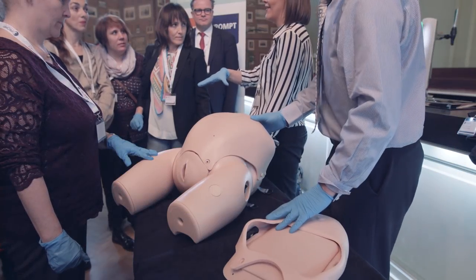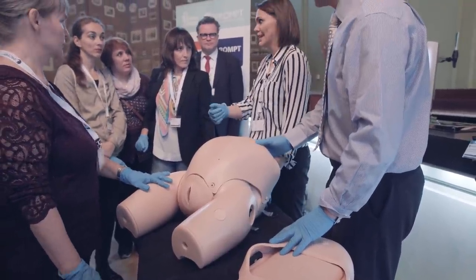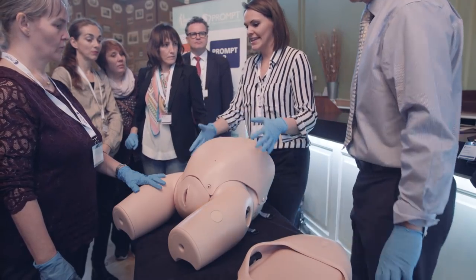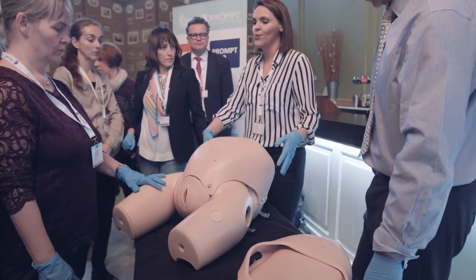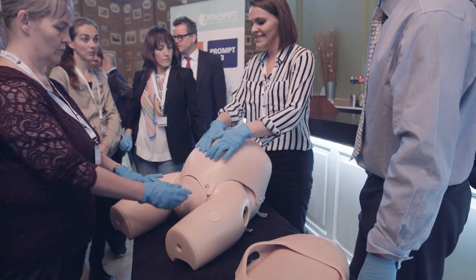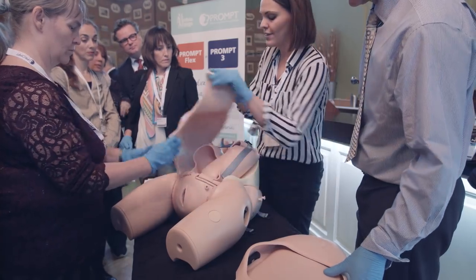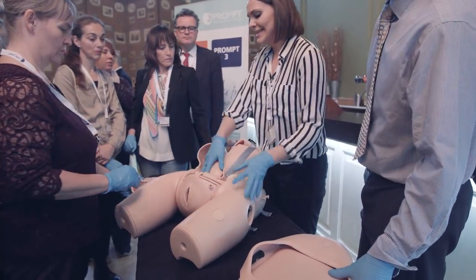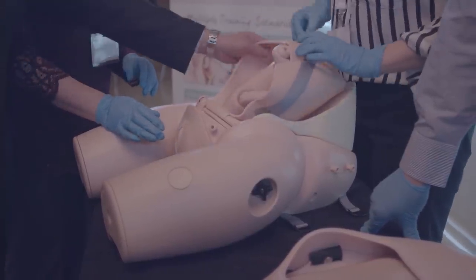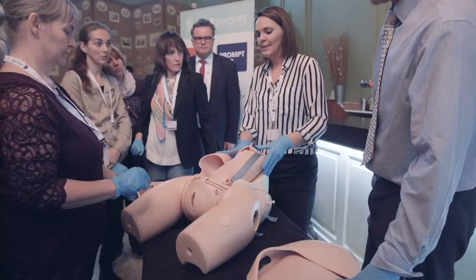This workshop is about use of the Prompt Flex mannequin for demonstrating and learning deeply impacted fetal head during cesarean section. The mannequin is your standard Prompt Flex mannequin but with additional modules — it has the cesarean section skin with a preformed incision, and underneath you have the baby deep and low in the pelvis simulating impacted fetal head. This strap is used to push the baby even lower and tighten it up.